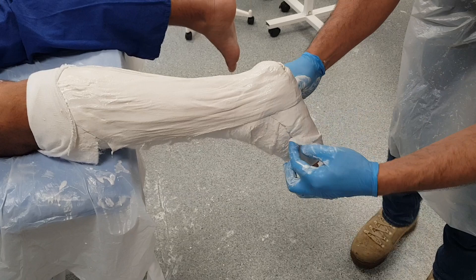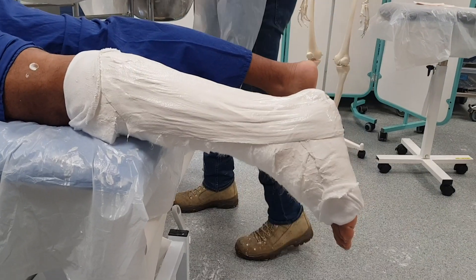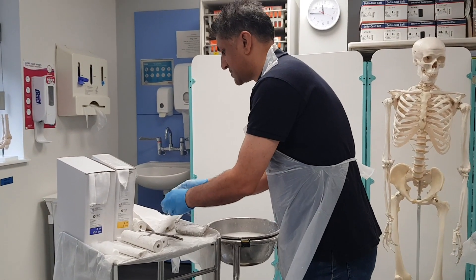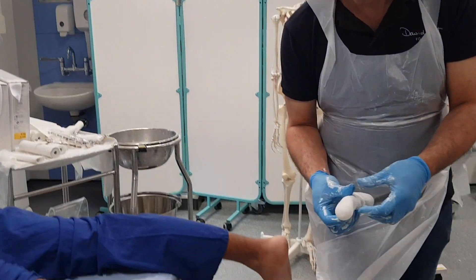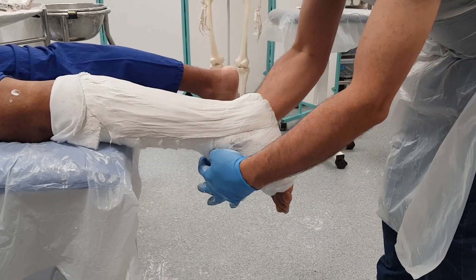I can fold back the stockinette to make sure I can see the little toe and the big toe. Then I can wrap it up with a crepe bandage — I'm going to soak my crepe bandage and apply it. This is going to stop the plaster from falling off the leg.